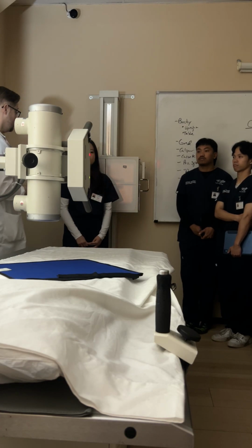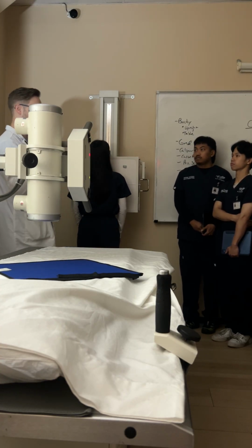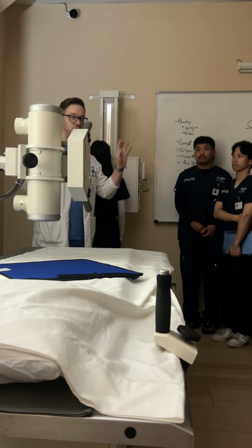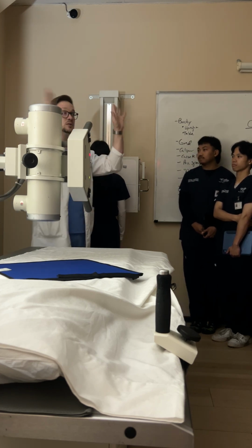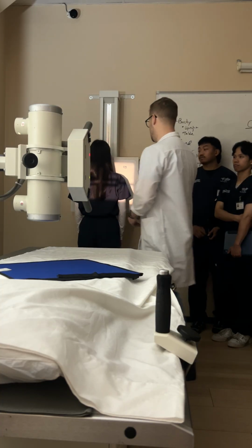Any chance you could be pregnant? Great. All right. So if you will, come right over here to my x-ray board. Put your chest all the way up against that board. First thing that I do. They have no idea what they're doing beyond that point. They're just where I need them to be in the room, okay? So now I'm going to start basing everything off of that, all right?